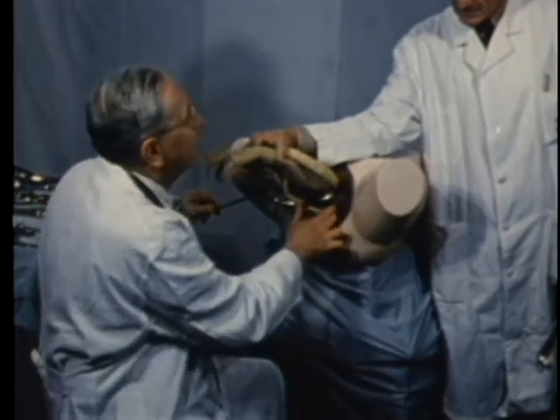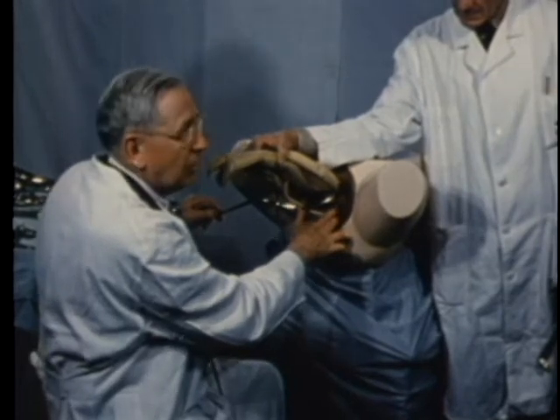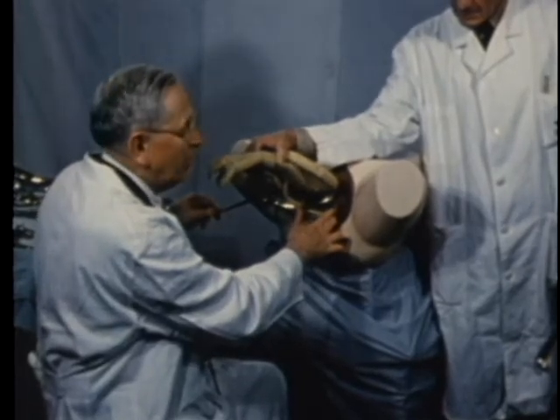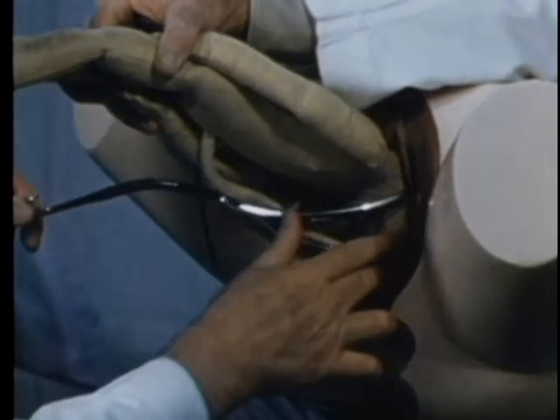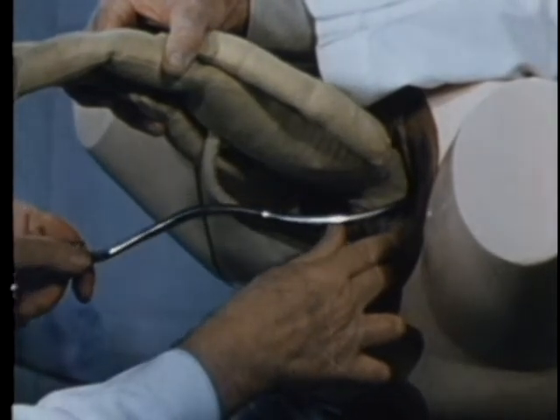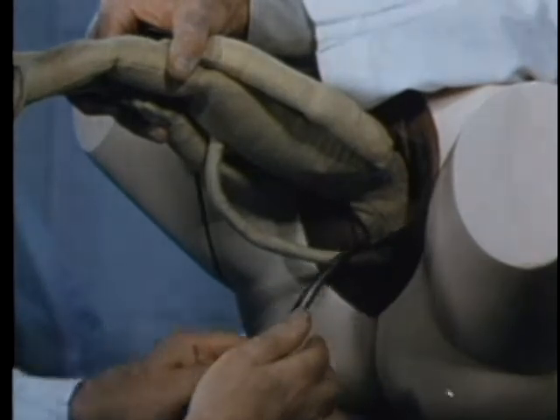Again, we have an exception to the four cardinal points of left blade to left ear. As in the breech presentation, the head is reversed so that the left blade goes to the left side, but opposite the right ear. It's carried directly in to the side, and the handle is brought around to the midline as the blade passes into the vagina.